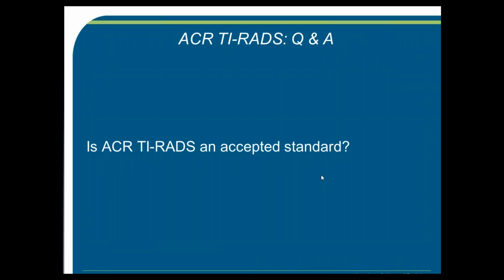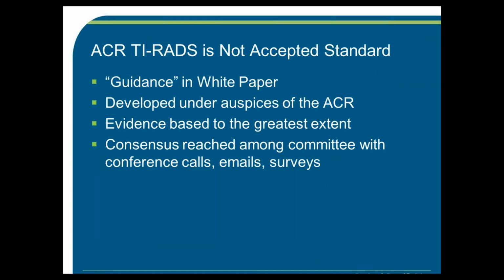My less commonly asked questions are, is ACR TI-RADS an accepted standard? And the answer is no. It's a white paper. It's guidance. It doesn't even meet the criteria of guidelines as required by the National Guidelines Clearinghouse. But it was developed under the auspices of ACR, and it is evidence-based to the greatest extent that we have it.